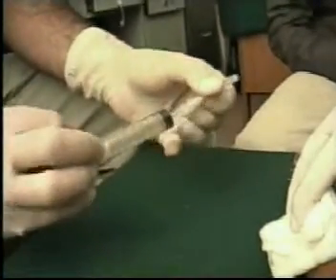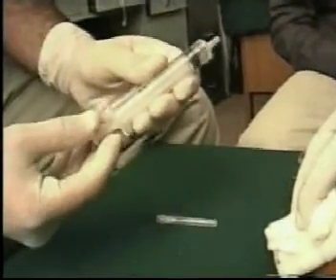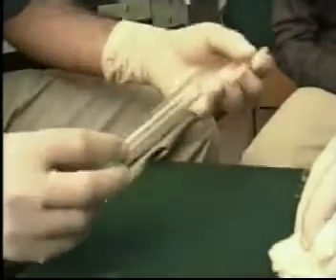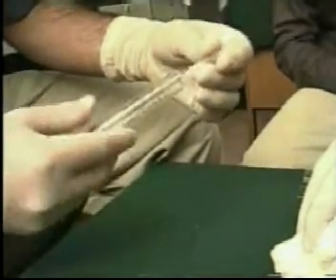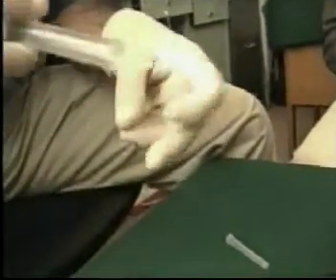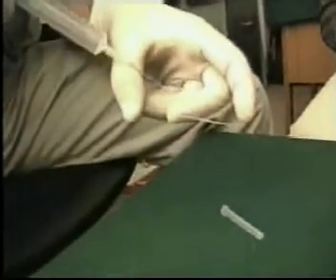Apply the cap of the syringe, remove the needle, suck air into the barrel, then reapply the needle.